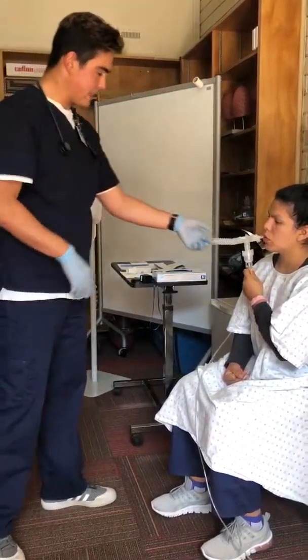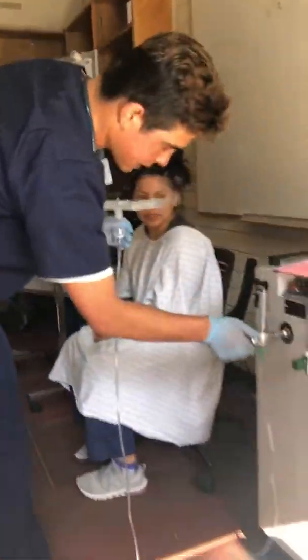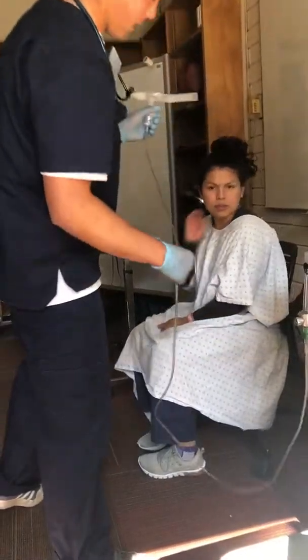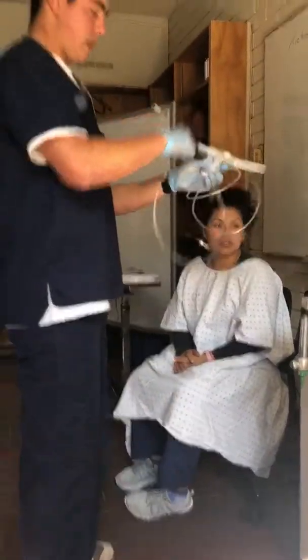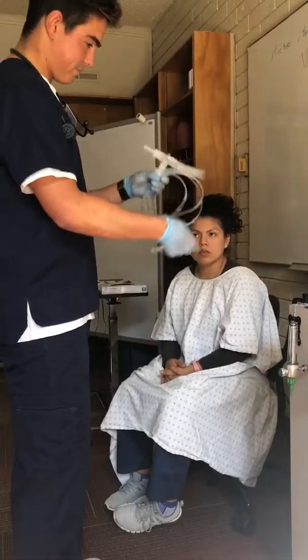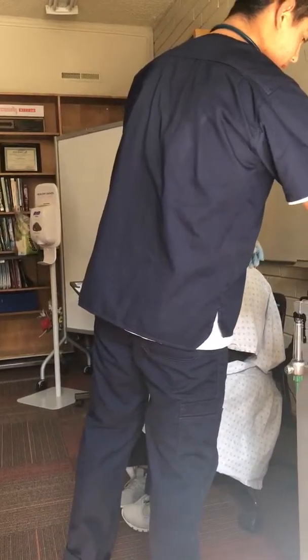So after that, we're going to go ahead and take this. Good treatment today. How do you feel? I feel good. Okay, we're going to go ahead and turn this off. Okay. So we're going to go ahead and clean this for the patient. In just a second, we're going to go ahead and reassess first. Okay, so there's the patient's back. We'll set that on top, and we can clean in just a second.